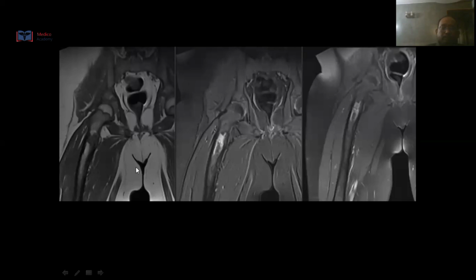This is an example where we are able to see that there is an aggressive lesion which is seen in the diaphysis of the femur of the unfused bone, which indicates a child. There is some cortical irregularity, and in this image, on the post-treatment, you are able to see that there is a decrease in the lesion size as well as the cortical irregularity.